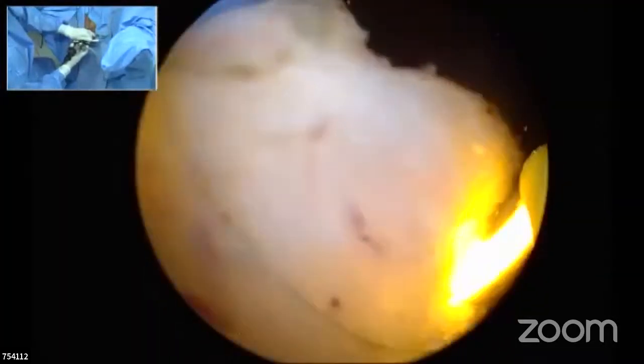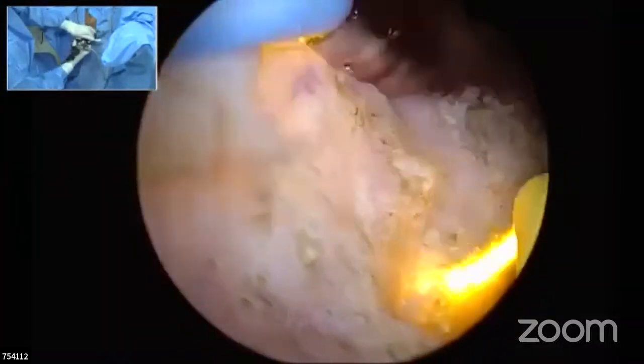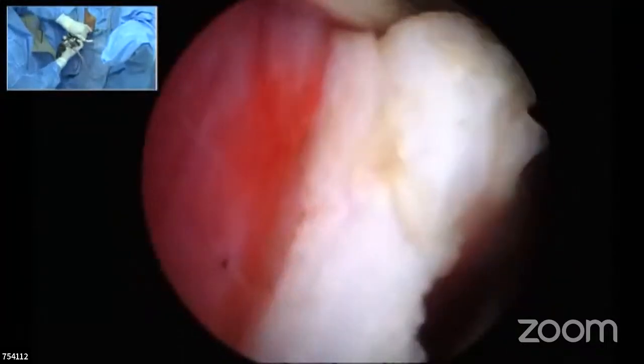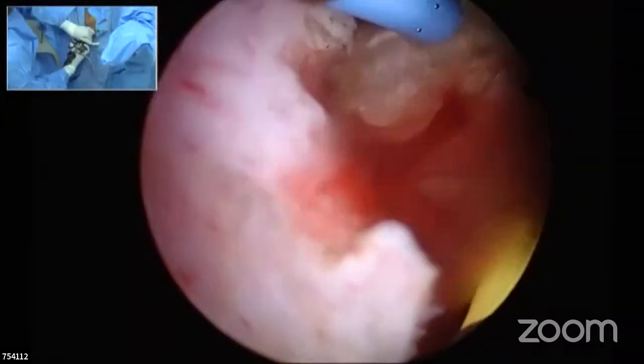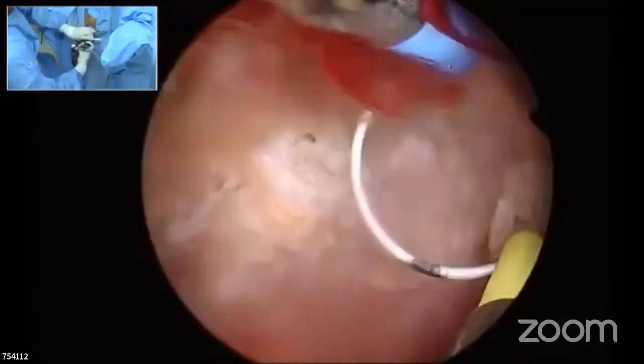Mali, there is a question in the chat box. Sometimes we find the lobes are big, close to the verumontanum. So what are the tips to resect that? No, this is exactly what I said. You keep that length already. I'll show this in this apex again, how to resect at the apex when it is going behind.